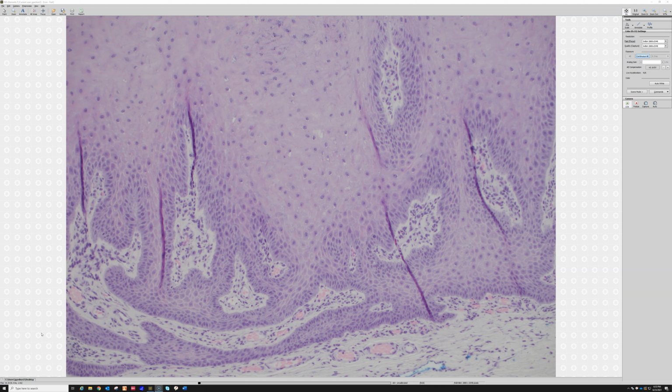Now, the reason that glassy matters is there are some types of squamous cell carcinomas that get very glassy keratinocytes, and there are also other things like keratoacanthoma, which I usually regard as a form of squamous cell carcinoma, although other people have strong opinions otherwise. But I've got a whole video you can go check out about that if you want to know. But in any case, there are other things that can get glassy. Hypertrophic actinic keratoses tend to get abundant glassy cytoplasm.